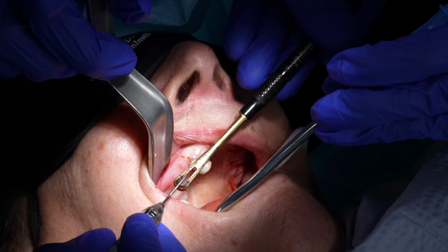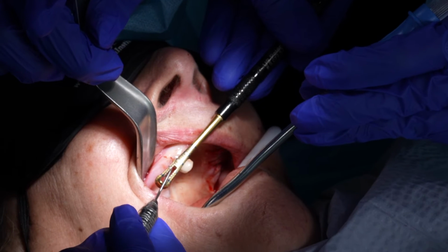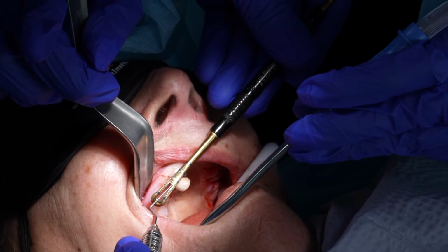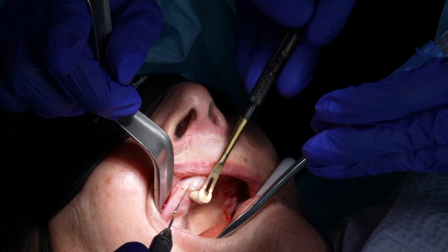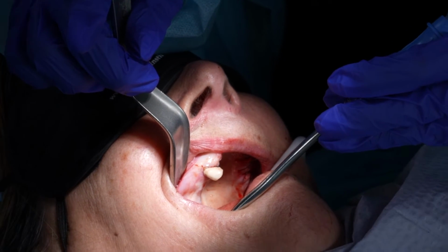This is the keyhole slot. We call this the keyhole slot because the distance from here to here is 10 millimeters. Why do I have that? So that we can use this for a quick measurement of the implants. I'm sorry, of the drills.